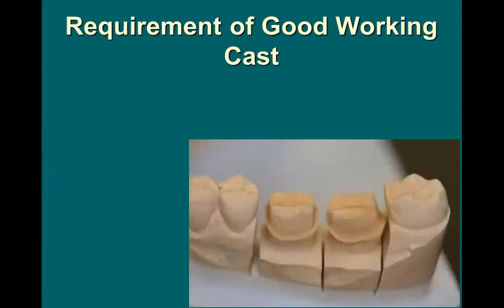The requirements needed for the produced working cast. First of all, it must be free from air bubbles.